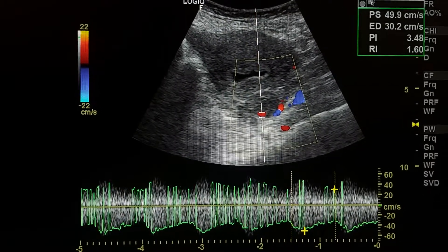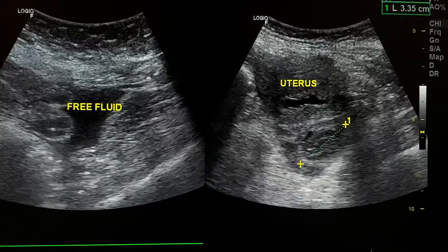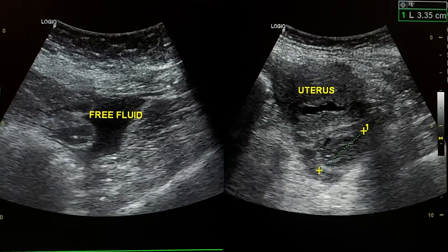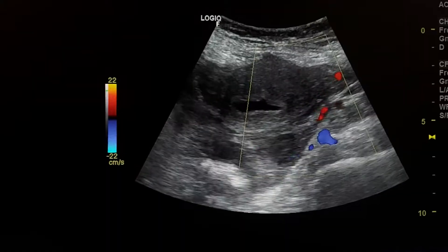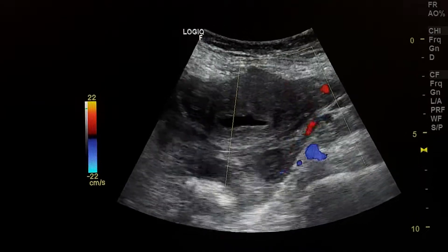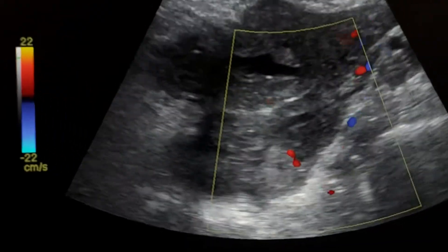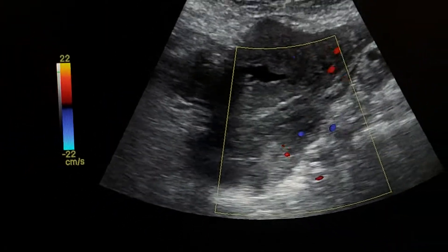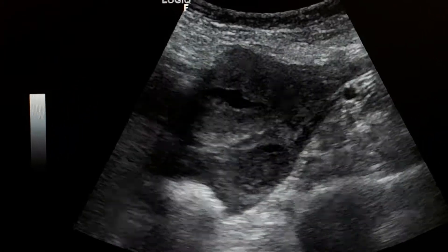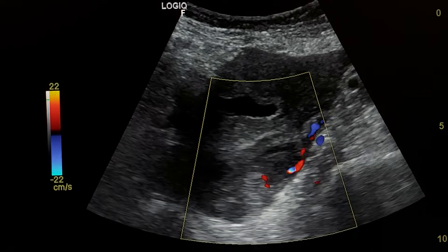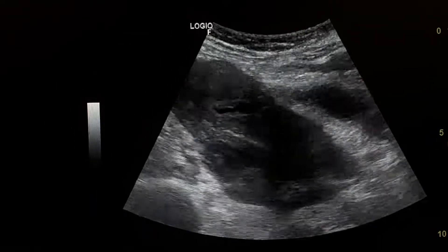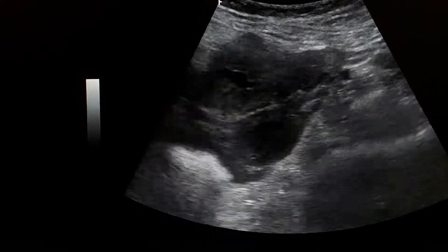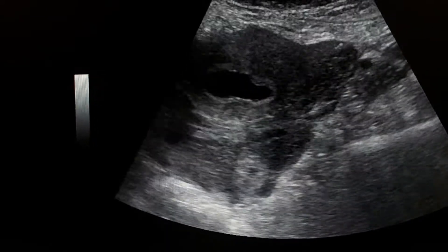The ring lesion was seen in the cul-de-sac, and here we see free fluid. This ring lesion in the cul-de-sac demonstrates color flow on Doppler imaging.